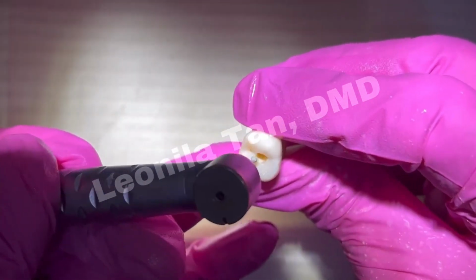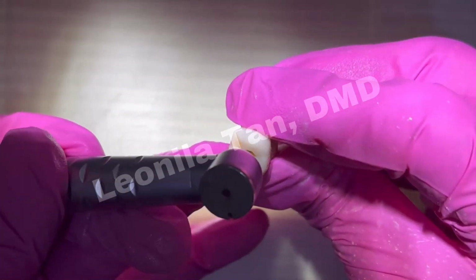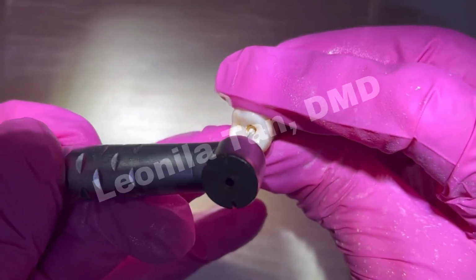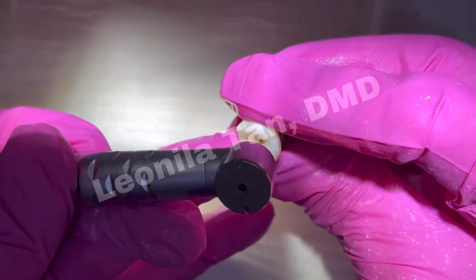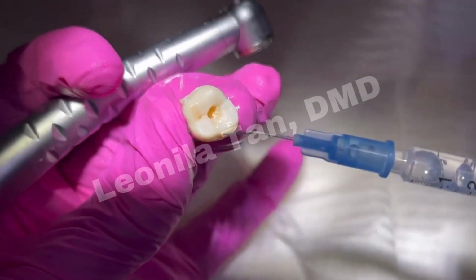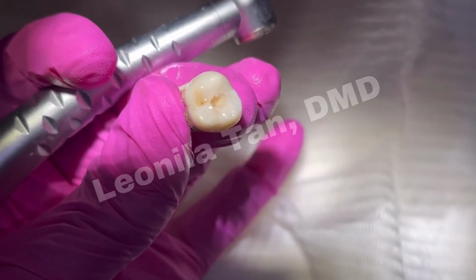So you continue to unroof. Notice I am going now toward the buccal side, again just feeling where you have those catches with the round burr. Then irrigate to clean the area. As I said, if this is a vital tooth, then you expect there to be bleeding.